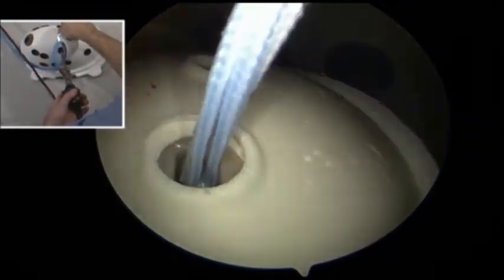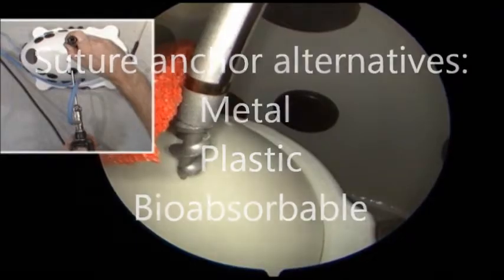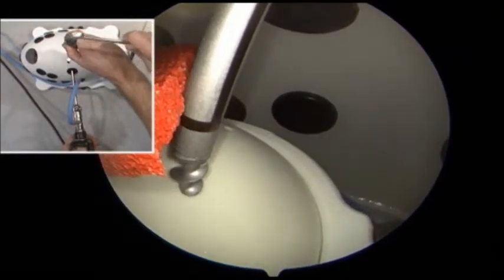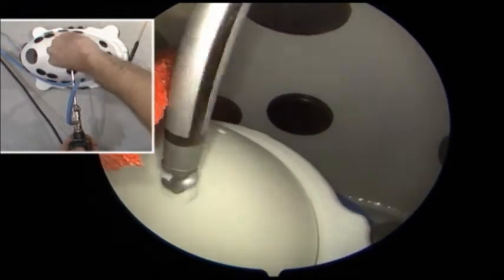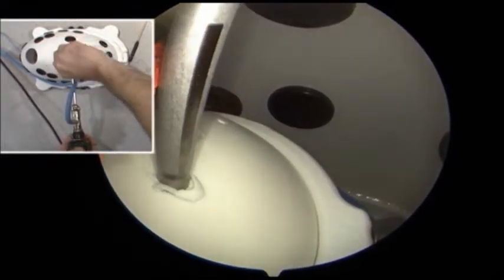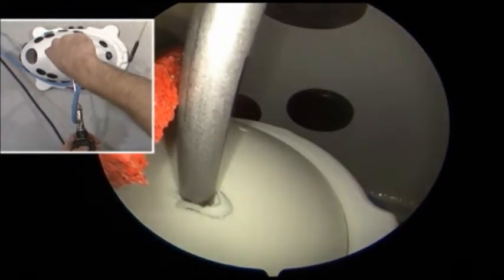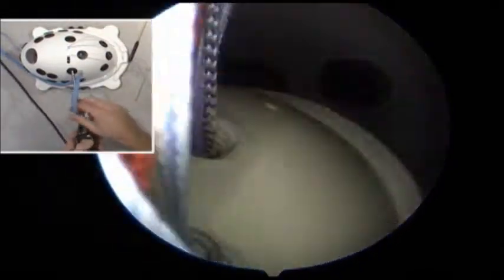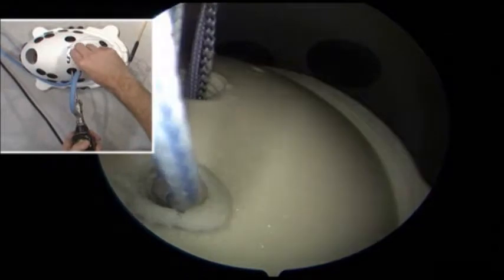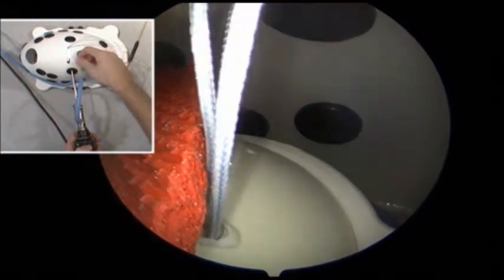Pull this back, give your anchor a little tug and make sure that it's sitting in there appropriately, and again you see that those sutures are going to slide appropriately. Go ahead and give me a tap to get that started. Good. And we're going to twist this in. And again, sinking it below the cortical bone, making sure the line is perpendicular to the edge of the tendon. Looking at the anchor, making sure that it doesn't pull out, and making sure that our sutures move freely.